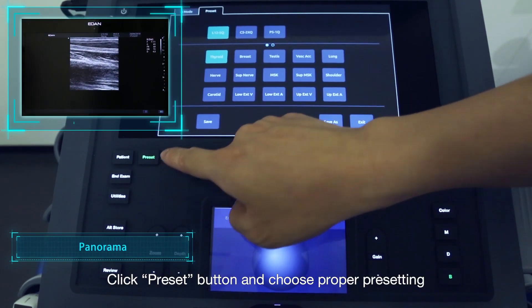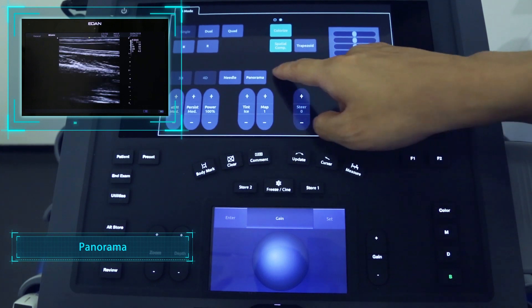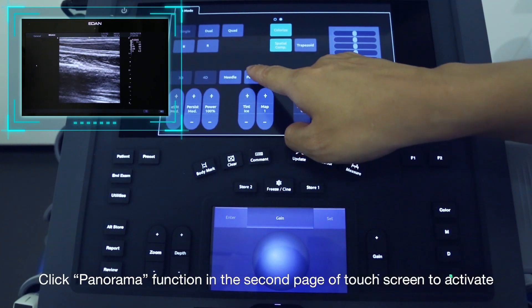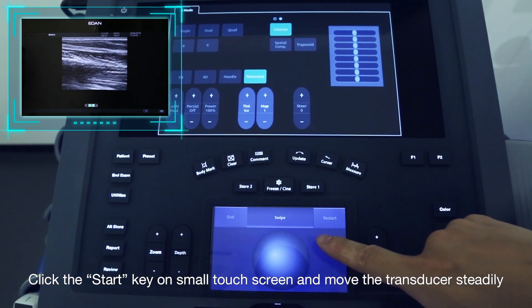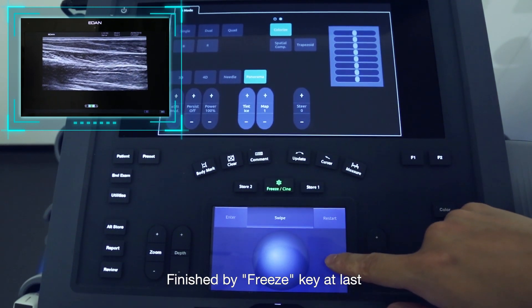Click the Preset button and choose the proper presetting. Click the Panorama function on the second page of the touchscreen to activate. Click the Start key on the small touchscreen and move the transducer steadily. Finish by pressing the Freeze key at last.